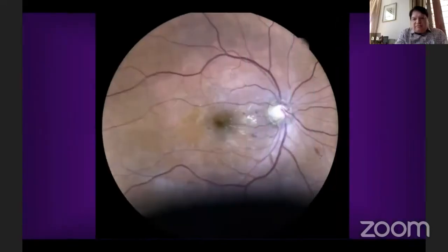Now, this is another case. When I saw this case, I was a little perplexed that this is a diabetic retinopathy. But I found that if you compare the upper retina and the lower retina, there is a difference in the extent of damage to the retina. But when I saw that, I said, well, angiography was done. It was a diabetic retinopathy with exudates between the disc and the macula. There are flame hemorrhages also. There were dot hemorrhages also.